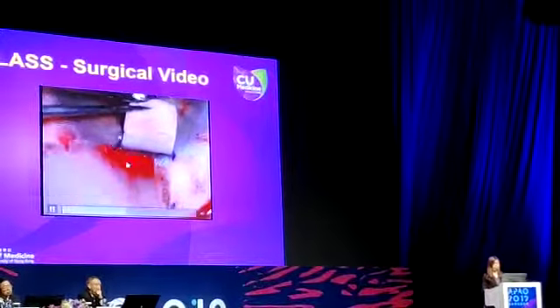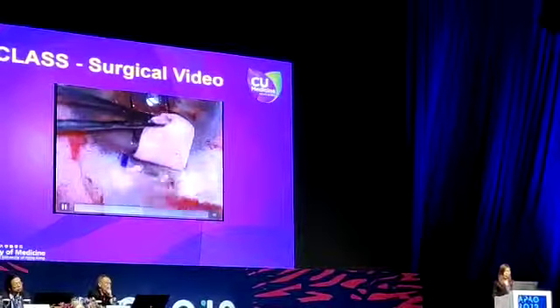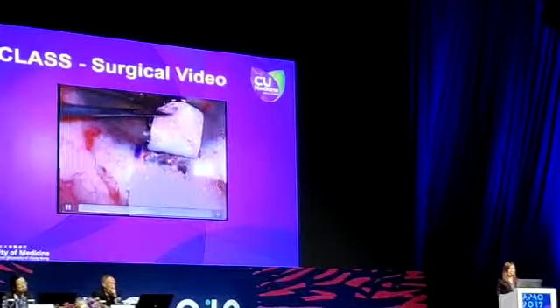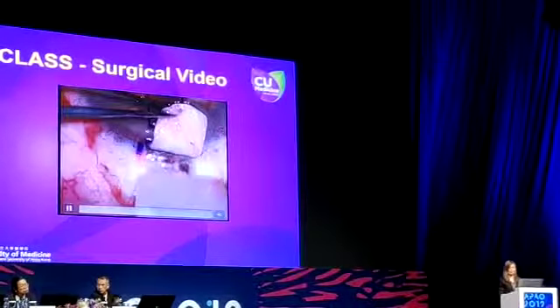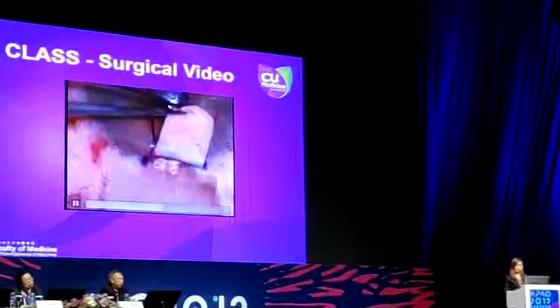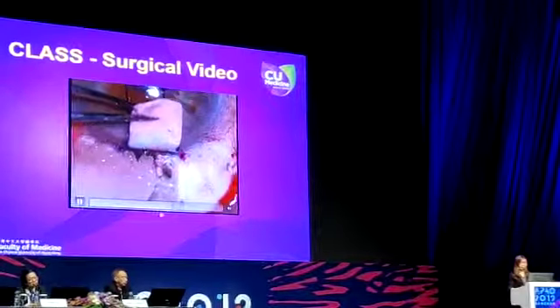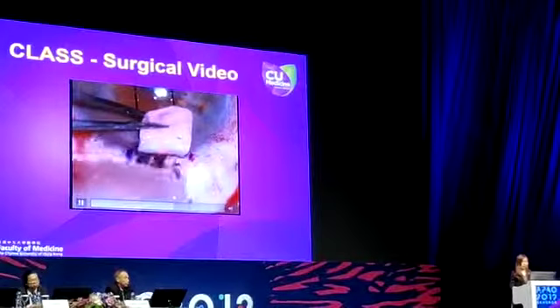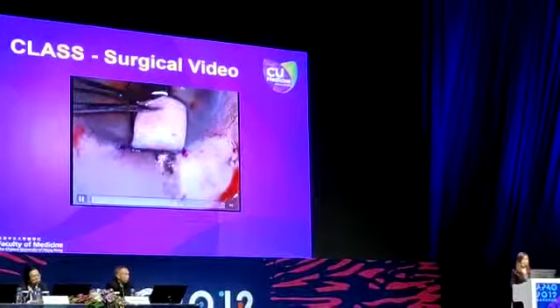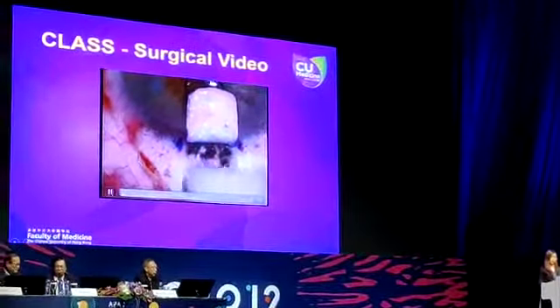And afterwards, you can start applying the laser energy to the gray zone, where you will expect to see percolation. And so while doing this, beware of the limbus line, not to go across it, otherwise you might result in some macroperforation. As you can see, we try to look at any fluid percolation and try to gauge how much laser to go forward. And in fact, theoretically, even if you continue to apply laser in this area, the fluid will avoid further laser absorption in the surrounding tissue.